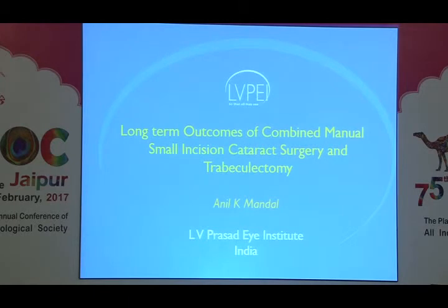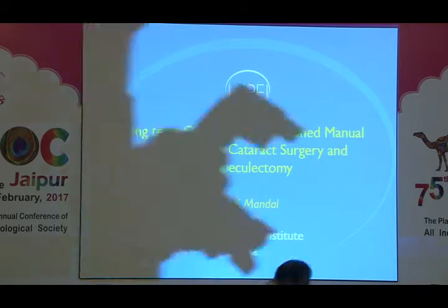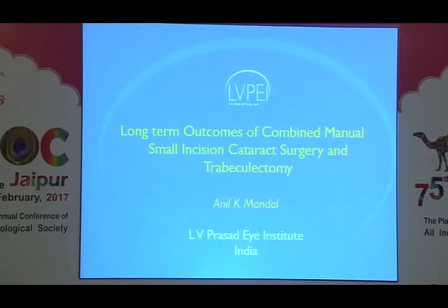My learning for combined cataract and glaucoma surgery was initially in my residency period, 84, 85, 86, in the form of trabeculectomy with intracapsular cataract extraction. We have seen results of that, and associated complications related to that procedure.